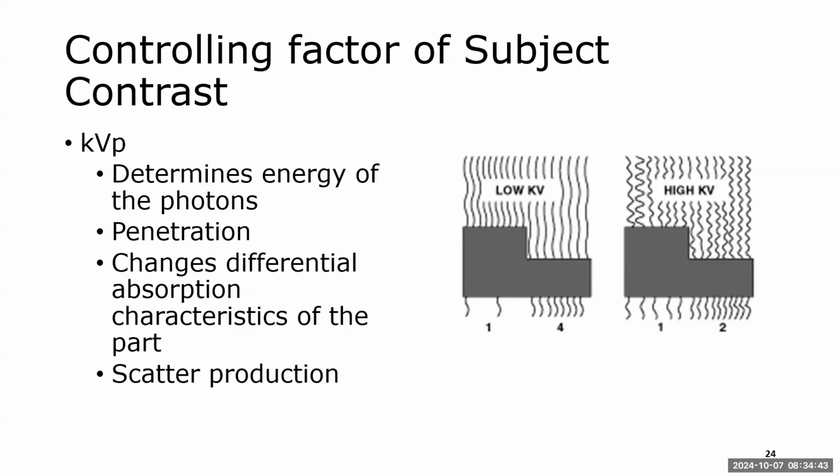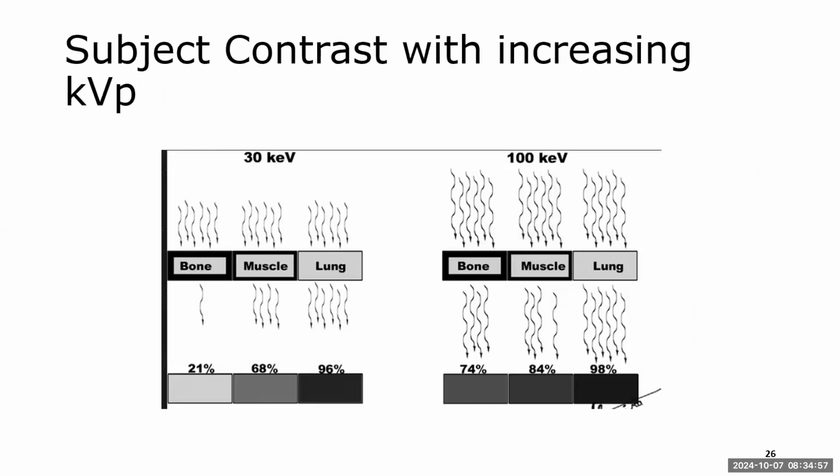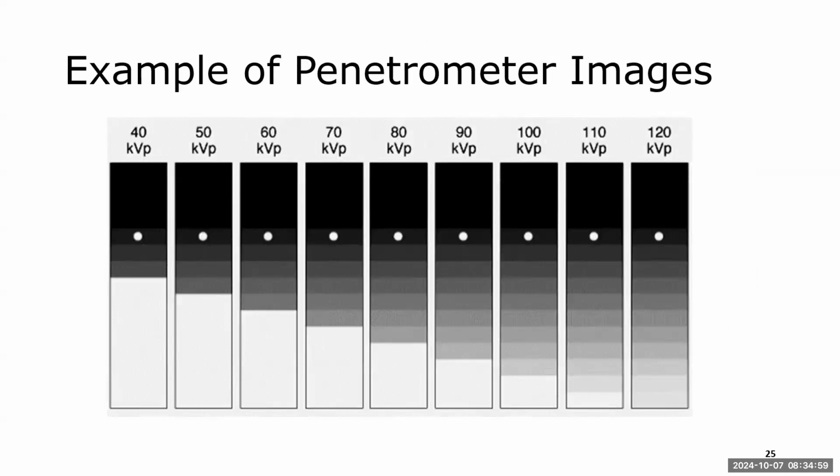With digital imaging, the display contrast is based on what? The computer, right? We can make it look however we want it to look. So you don't have that visual that we had with film. I think I actually have a video in there. Hopefully it'll play. If not here, I'll make sure that you can see it. That's something I did with film a while ago.